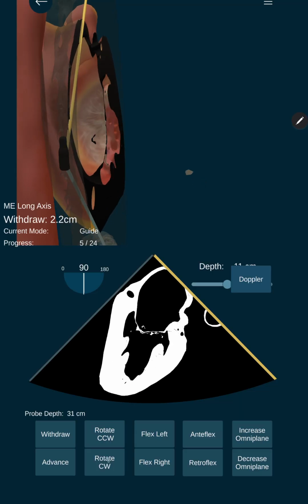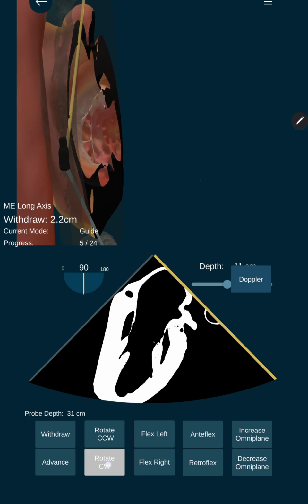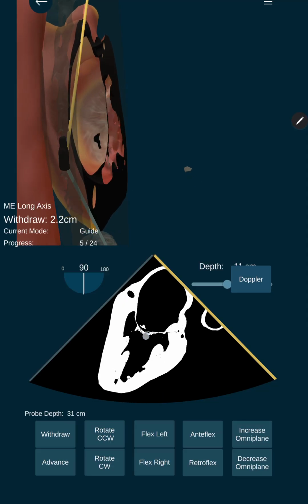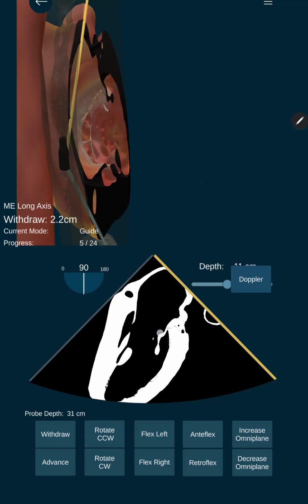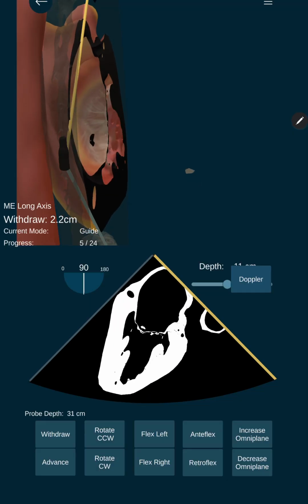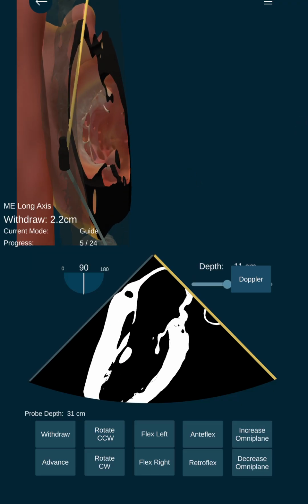A little fine adjustment is required, wherein we can change the plane. So this whole thing is the anterior mitral leaflet with A3, A2 and A1 segments of the AML and a part of the PML, that is the P3 segment, at the 90 degrees mid-esophageal view.